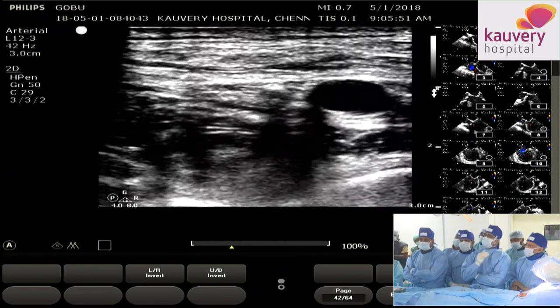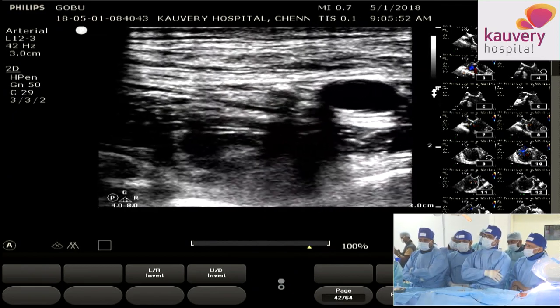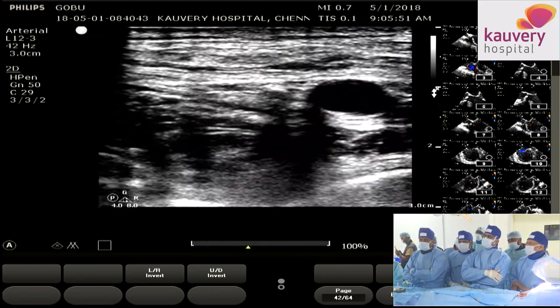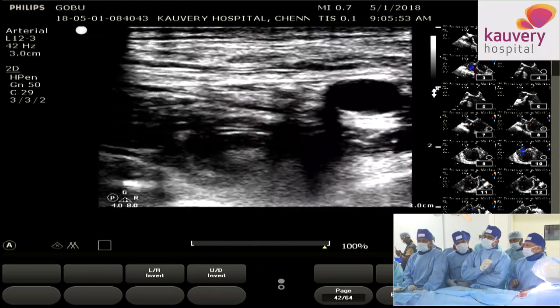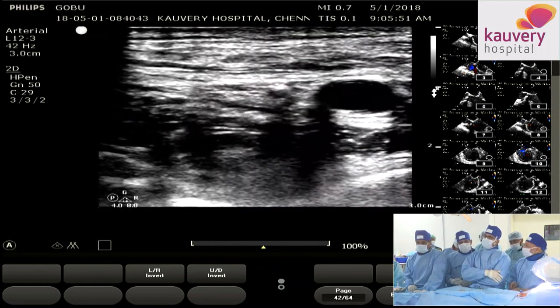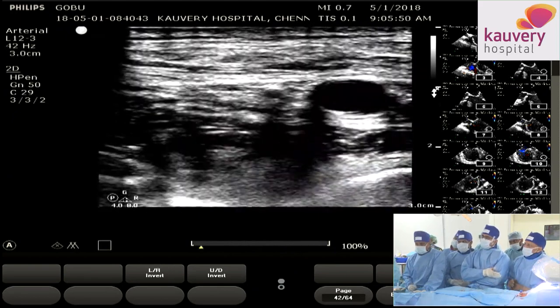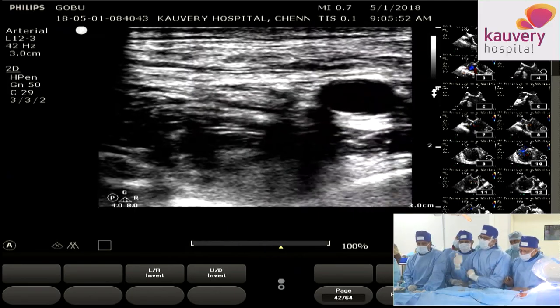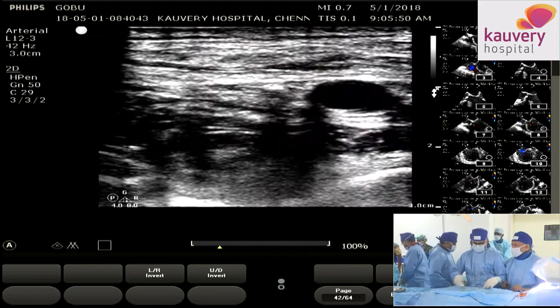So based on the echo valvular assessment, we have decided to go for a 23 millimeter Evolut because it's a true bicuspid, and the intercommissural distance has been seen, but the annular diameter average is 18, maximum 20. 18-19 maximum. So I shall hand you over to Dr. PC, who will go through the fluoroscopic stuff while we get the valve ready. Okay.